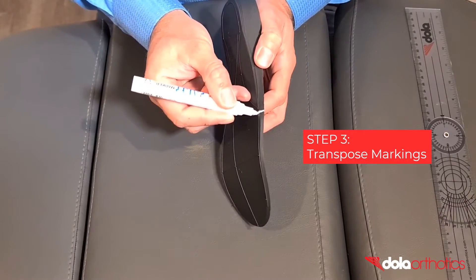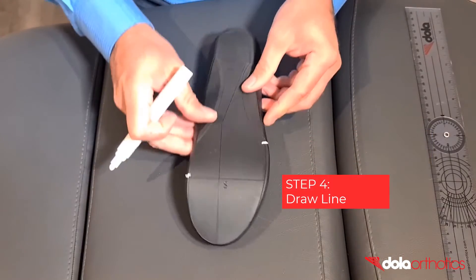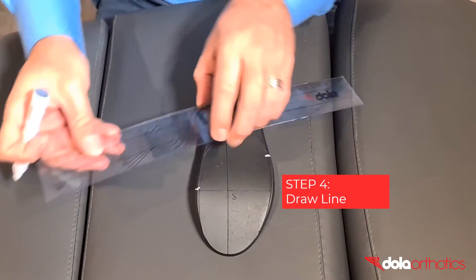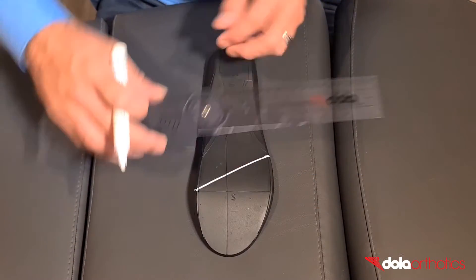Step 3: Transpose the medial and lateral markings onto the plantar surface of the orthotic. Step 4: Connect the two points with a line to indicate the angle of the gait plate. You now have your out-toeing gait plate marked as a guide.